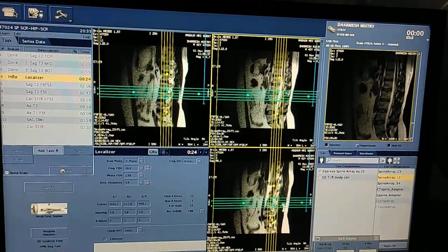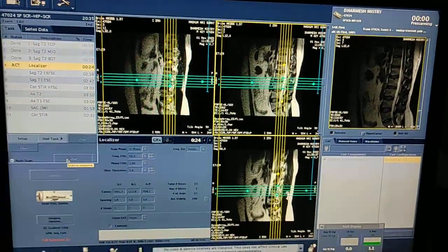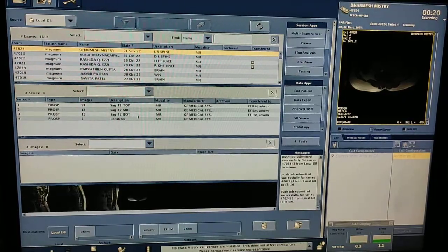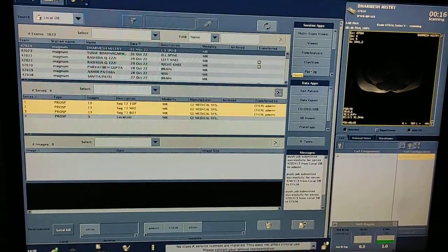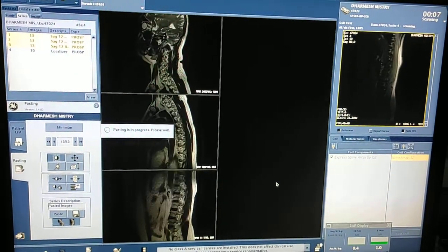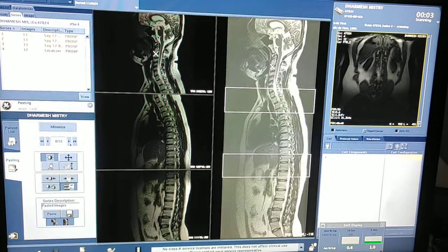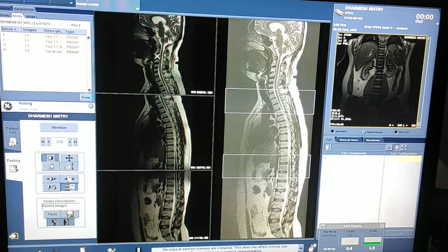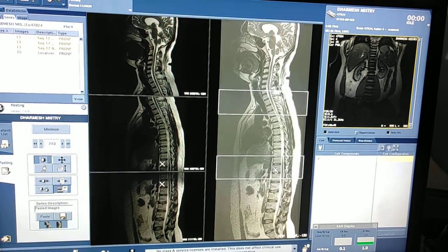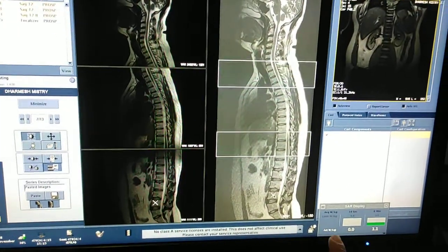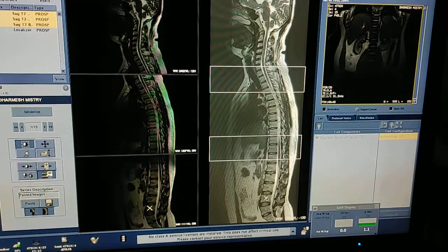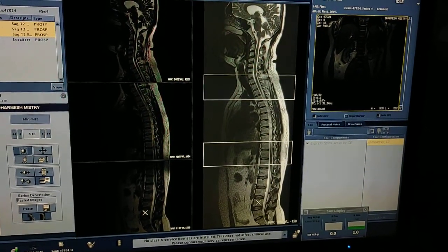I have taken the whole spine screening for counting purpose — to determine whether it is lumbarzation or sacralization. Go to the main window, select all three: top, mid, and bottom, and click Pasting to paste all three sequences. Now count all the spinal levels: this is C3, 4, 5, 6, 7; then T1 through T12; then L1, 2, 3, 4, and 5. You can see L5 is here, and this is S1. So this patient has lumbarzation of a vertebra.